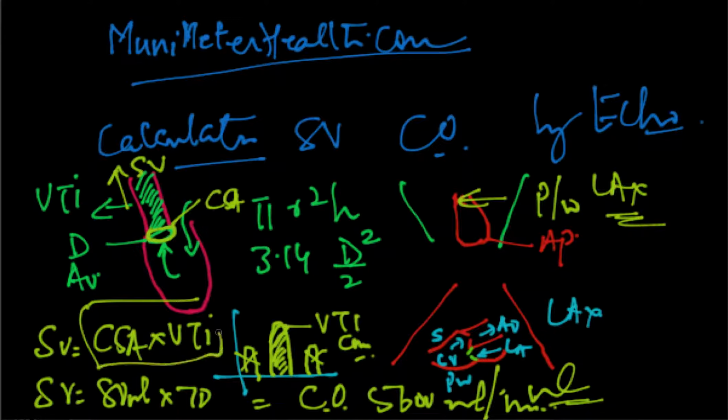Now, this equation is very important. By the way, this will be on the boards for the cardiovascular fellows and, of course, third-year residents if they want to really aspire to become cardiologists. All right. And of course, for my colleagues, just to brush up quickly, I've given this spiel as to how you calculate, because time and again, we always forget these equations, but normally our technicians are very good about calculating it, but I think it's a good idea to always double check, and this way we have a good idea about what the cardiac output in that individual is.